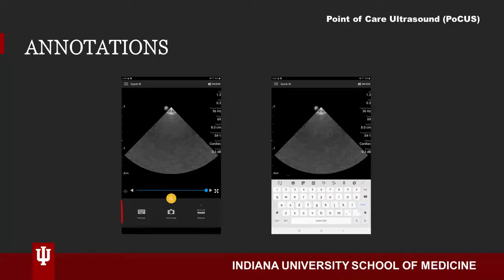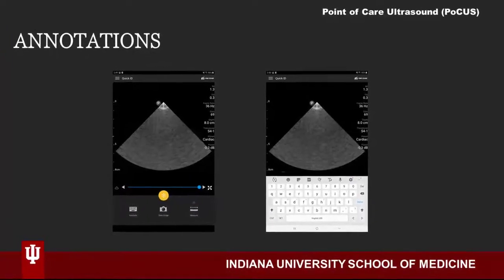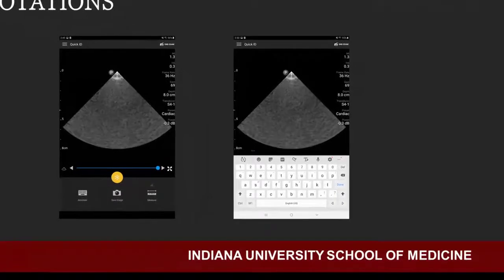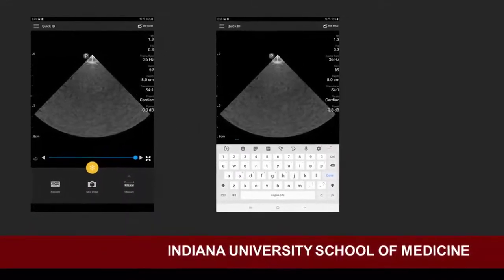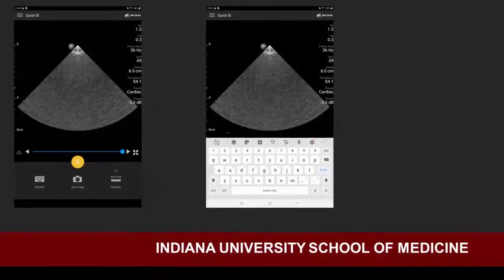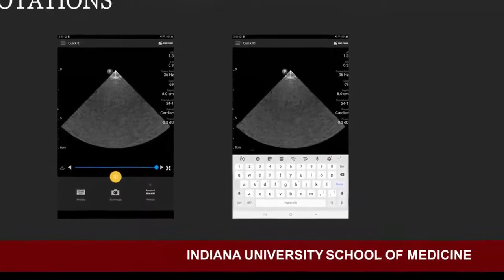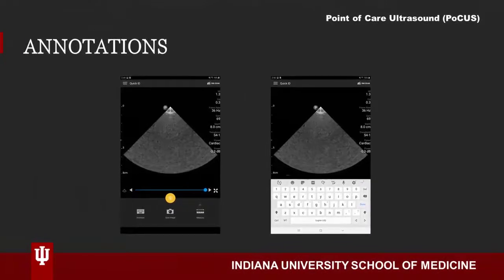Also found on the frozen screen is the option to add text to your image. Once you initiate annotations, a larger version of a keyboard will appear. The keyboard has many features beyond standard text, including frequently used terms under the double arrow T icon, emojis, scribe, auto-dictate, and alternative keyboard language options. Unfortunately, stickers, GIFs, and live message are not functions within the Lumify application.